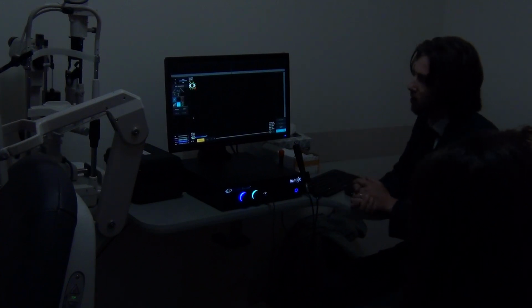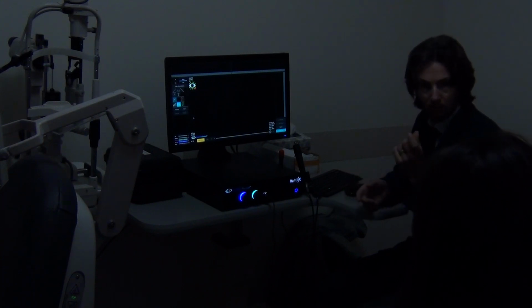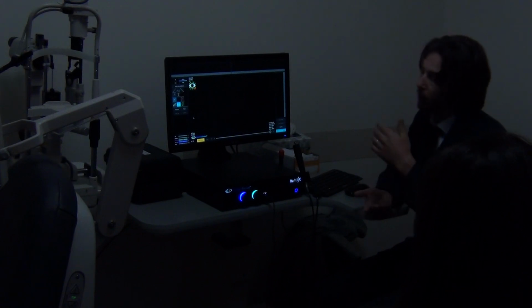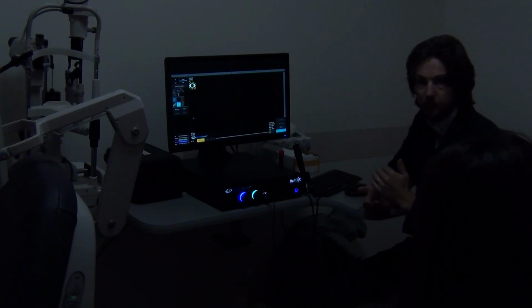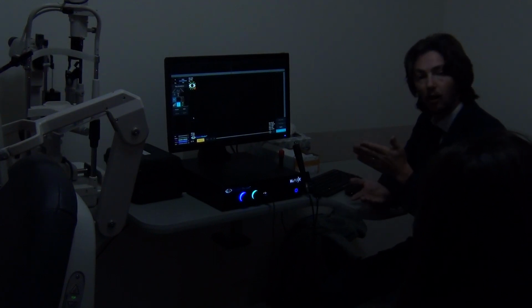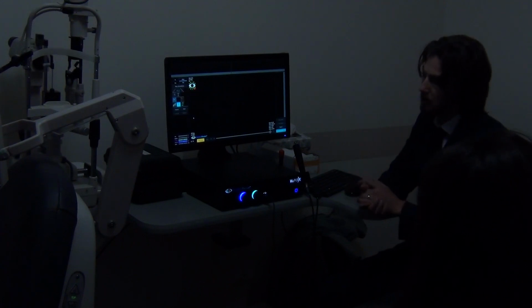Right. And of course you always take into consideration the pupil size. Like larger pupil area means you are on diameter of the pupil, right? You need to look for the bright areas such as cornea, front of the lens, back of the lens. If you don't see, let's say, back of the lens on the screen, that's when you're slightly angled and you're not really getting the picture. So I wouldn't take into account this image for the sulcus to sulcus measurement.